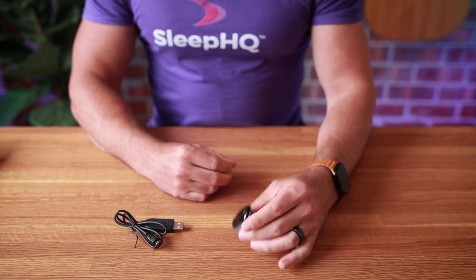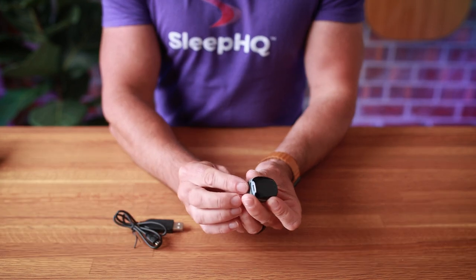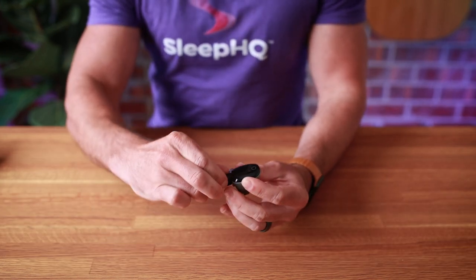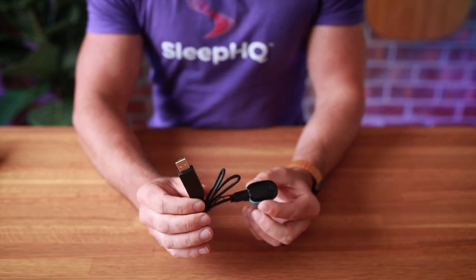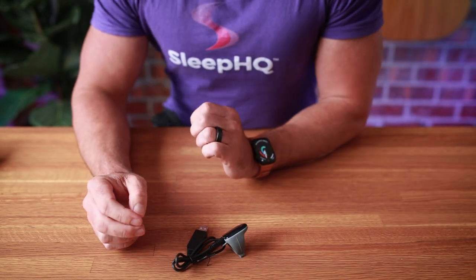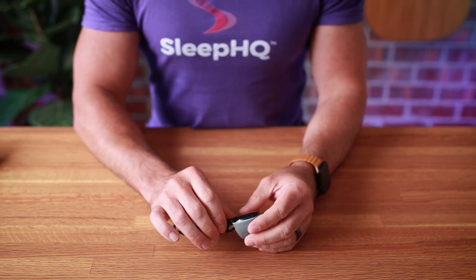First things first, we need to charge the ring. It will have some charge on it, but we'll charge it up to full. Peel down the little flap on the back and just plug in the micro USB-C — the other end is a standard USB. Charging takes about three hours and once charged, the ring should last between 12 to 16 hours. I recommend charging each day prior to use.